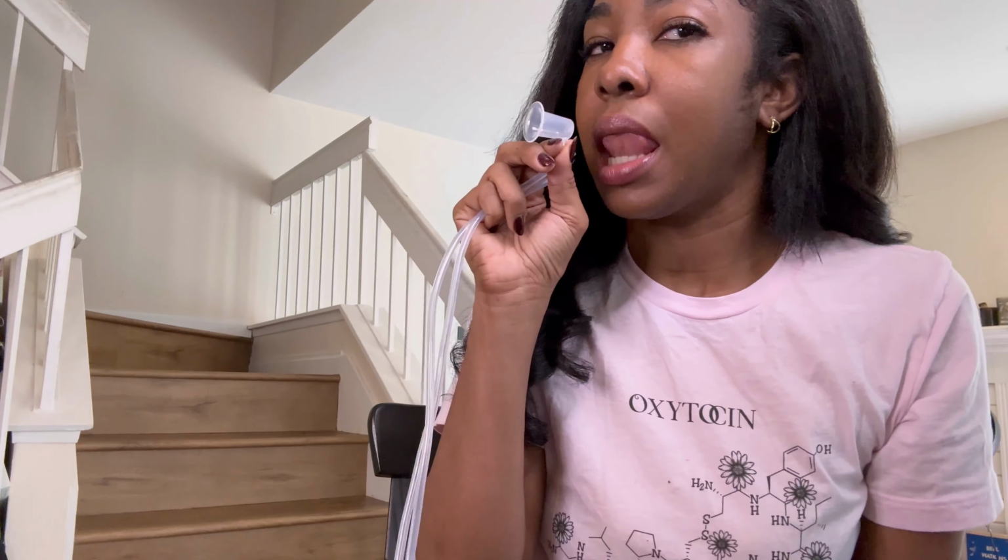If you use it more than once a day, you wanna wait for about 5 to 8 hours apart in using it. Again, if you have any pain or bleeding with this tool, I would say that you should stop using it.